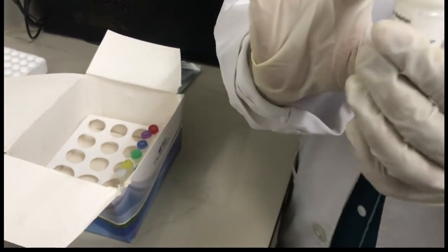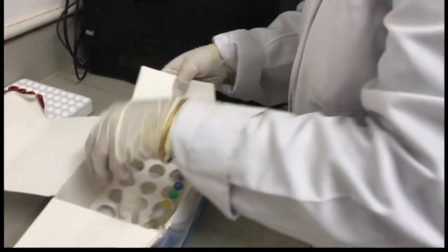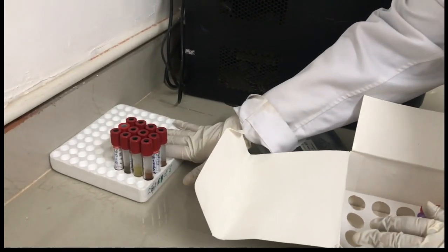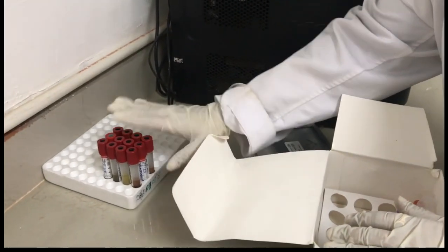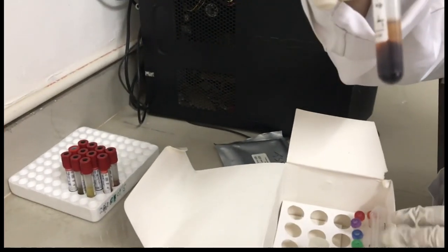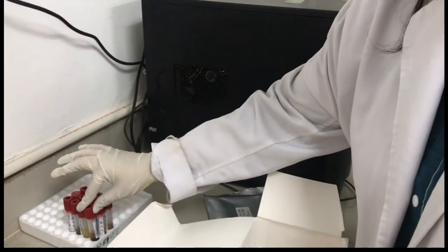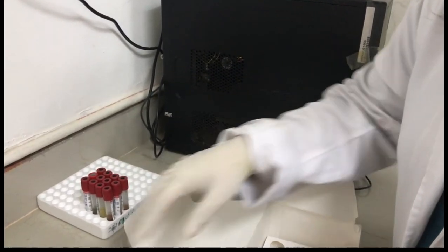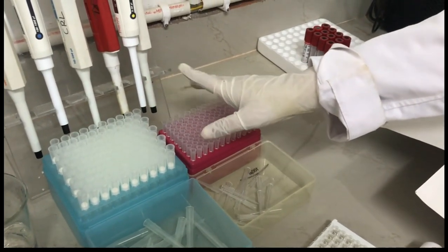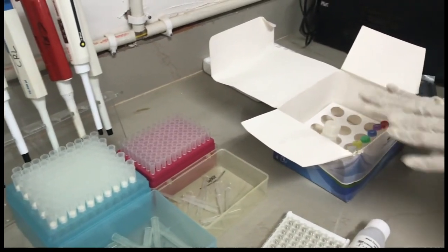Now we are going to start with the procedure. These are the samples which we have kept already, which we are going to measure the TSH levels in. The serum which we have already centrifuged has been kept in vials. These are the micro tips which we will be using. These are the micro pipettes which are used. We are going to start the procedure.